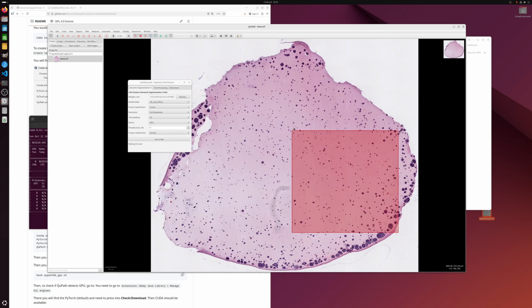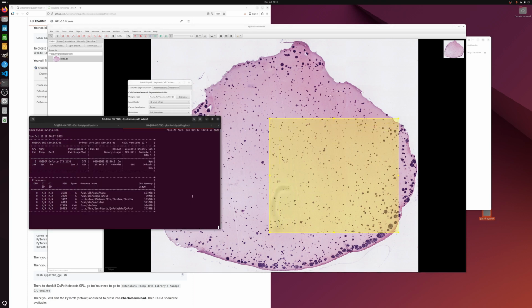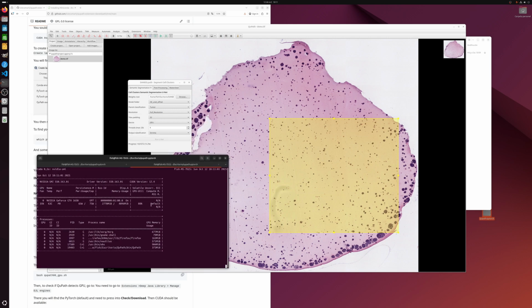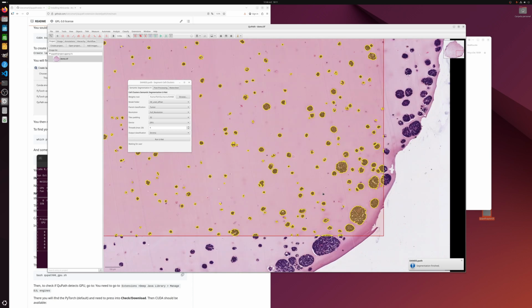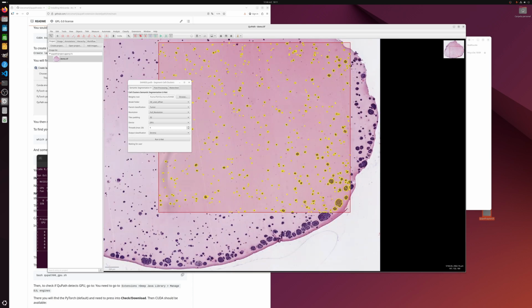But we can come over here, set run the unit, and you will see that it's 99%. And yes, the acceleration, even with this entry-level GPU, is really big. So if you have an NVIDIA GPU, we strongly recommend you to use it.